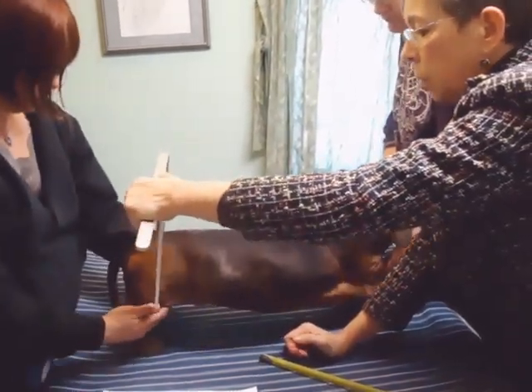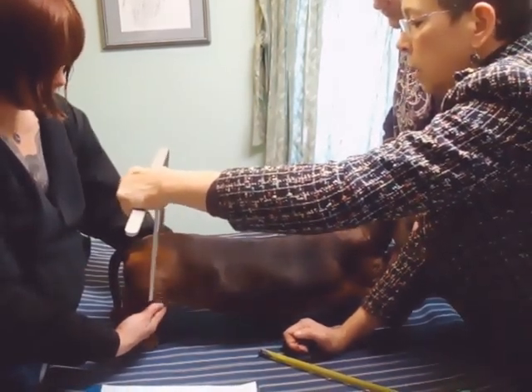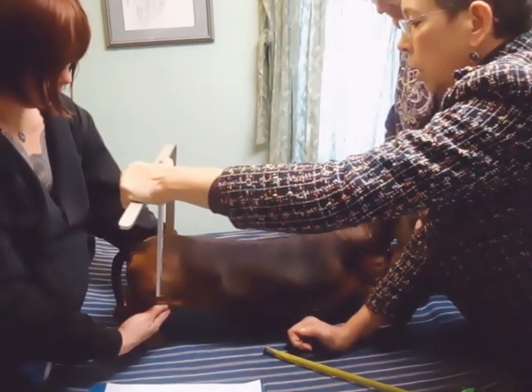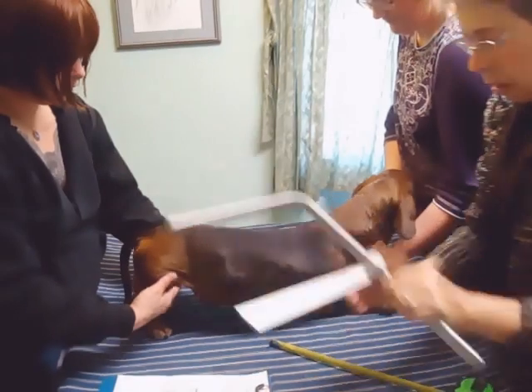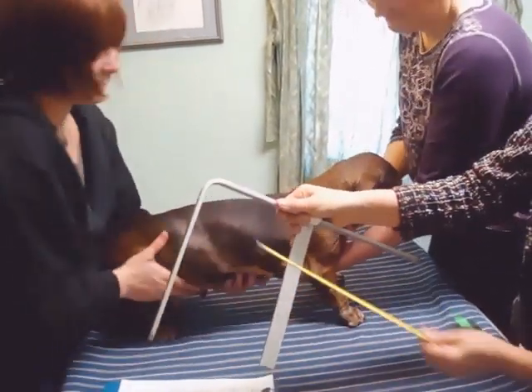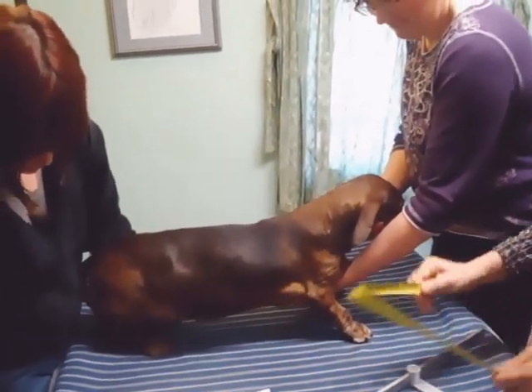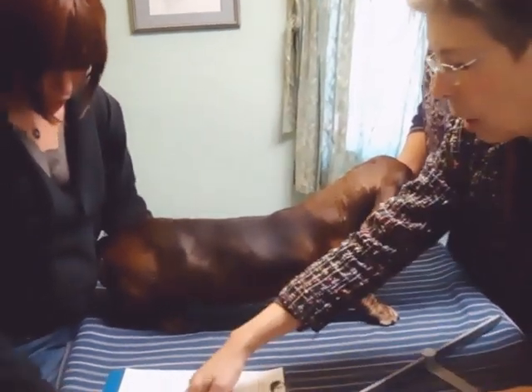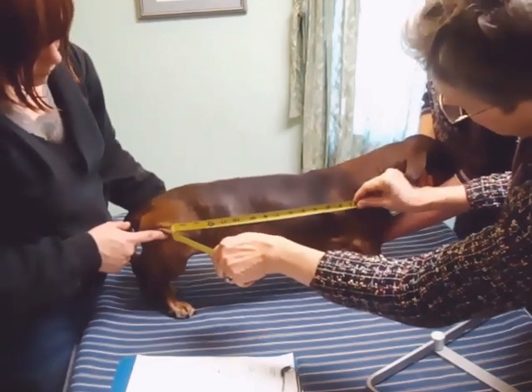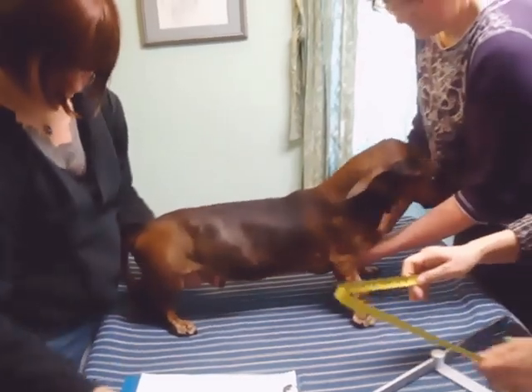You want to take into account the biggest musculature of the thigh — this is where the saddle is — and we want to make sure he can use his back legs comfortably. For that we've got six and three-quarters. We also need center of shoulder to center of thigh, which is a double-check measurement for us, and we get 15. That should be B plus half of C, and that works out just fine.